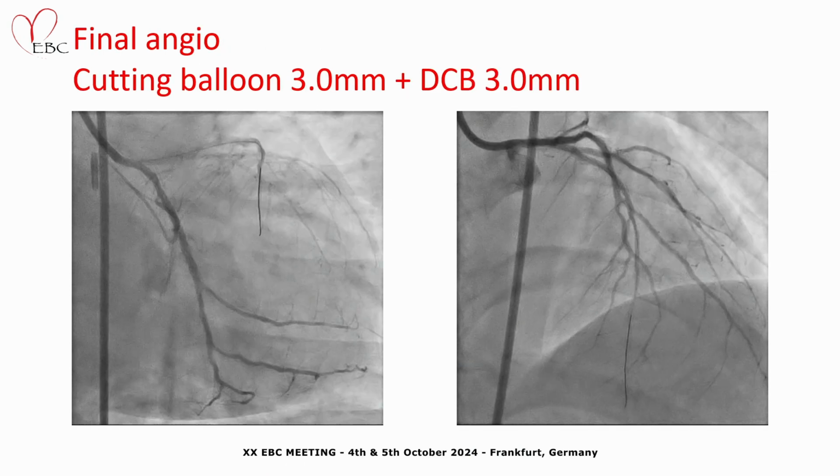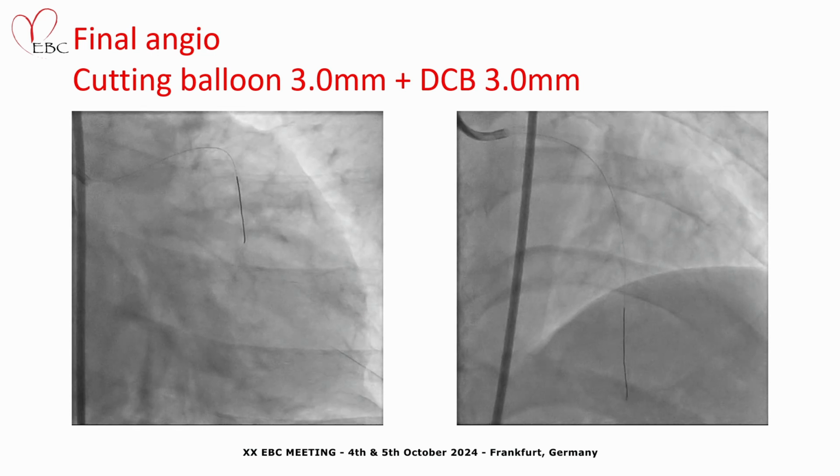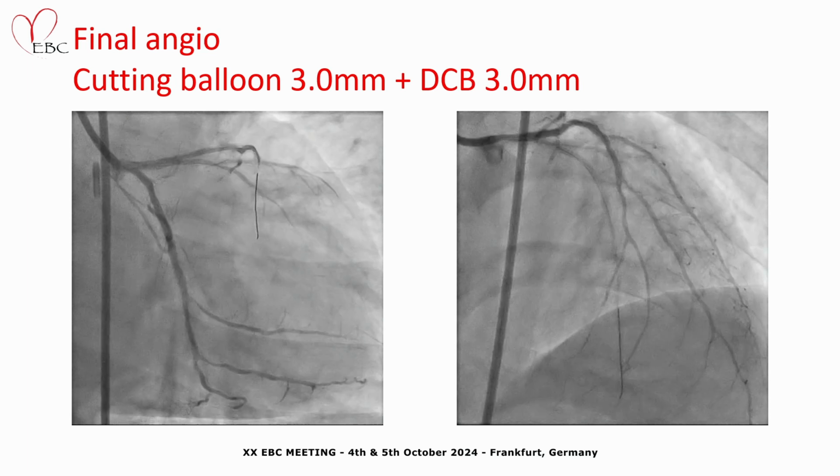So I dilated both regions by using the 3.0 cutting balloon, and then the drug coating balloon, and this is the final angiogram, maybe an acceptable result.